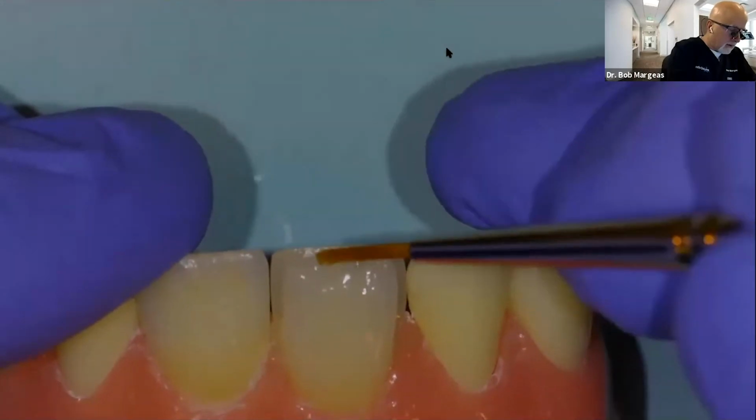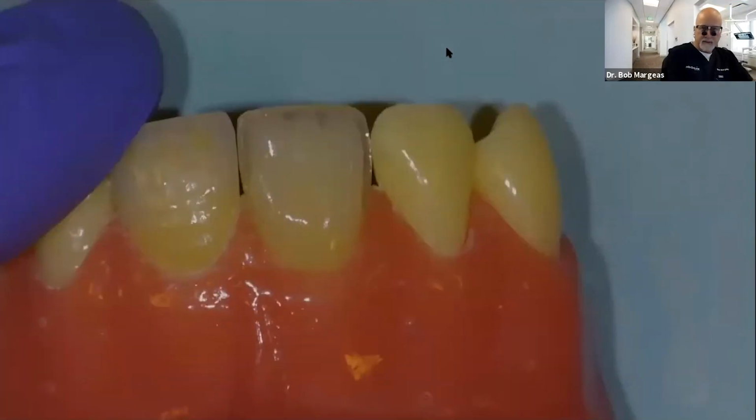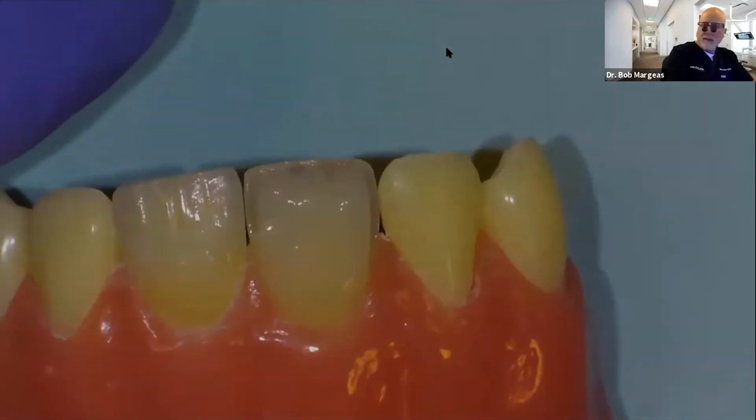If you didn't have all this trans, you may not put that violet between there, okay? And now I'm going to light cure that. Now, the other way of doing that is I could have taken an achromatic shade of Evanescence, like the clear translucent, and filled that in, but I chose to use tinting instead.